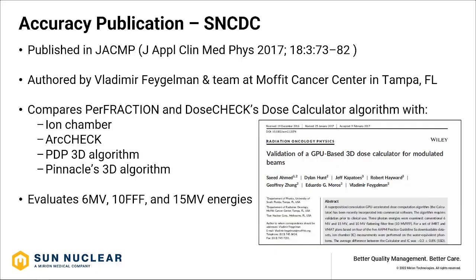Okay, so I've just provided you a link to the paper that I was discussing, the paper that compared the dose calculation engine within SunCheck with the ion chambers, as well as Pinnacle's algorithm as well.